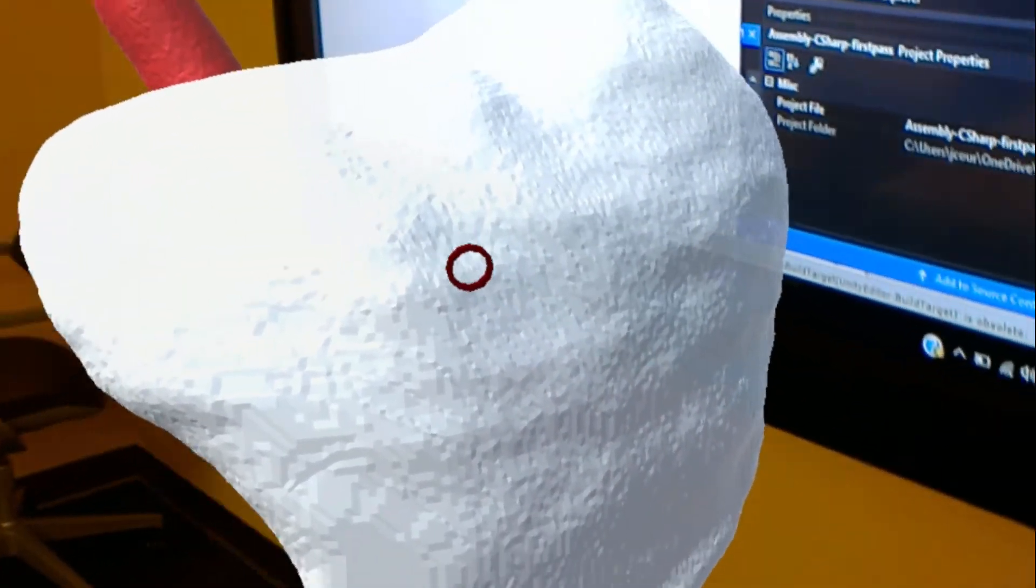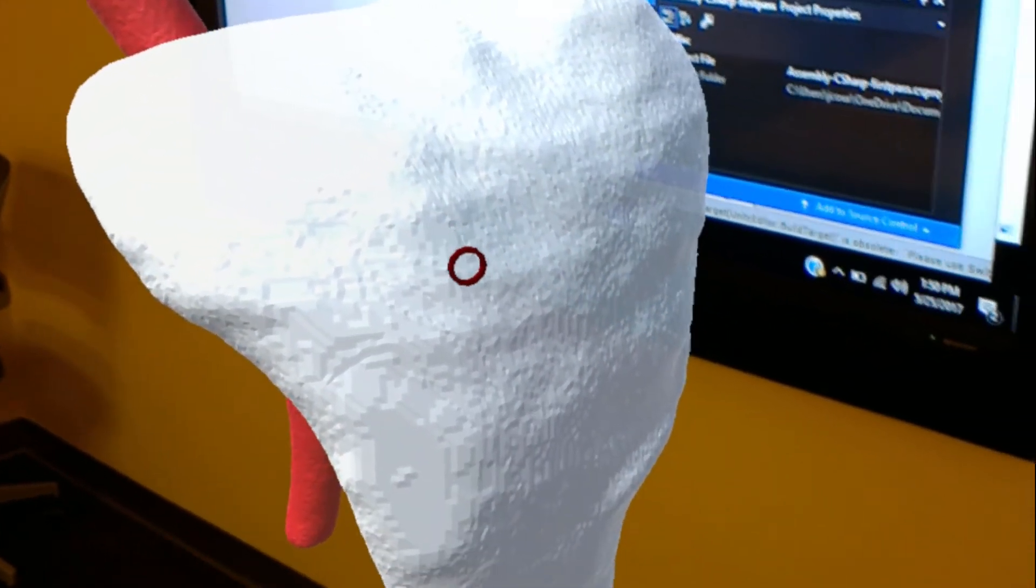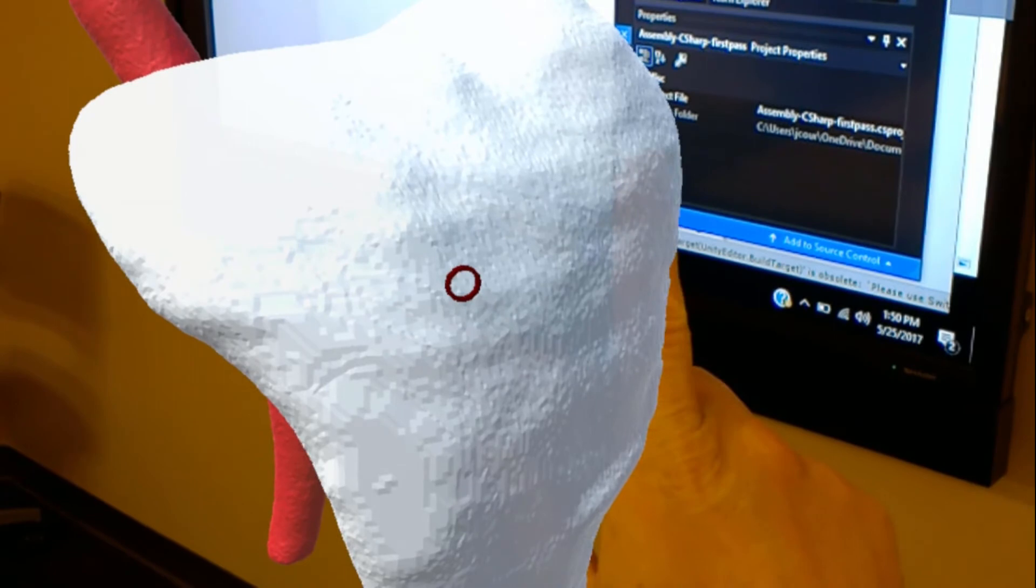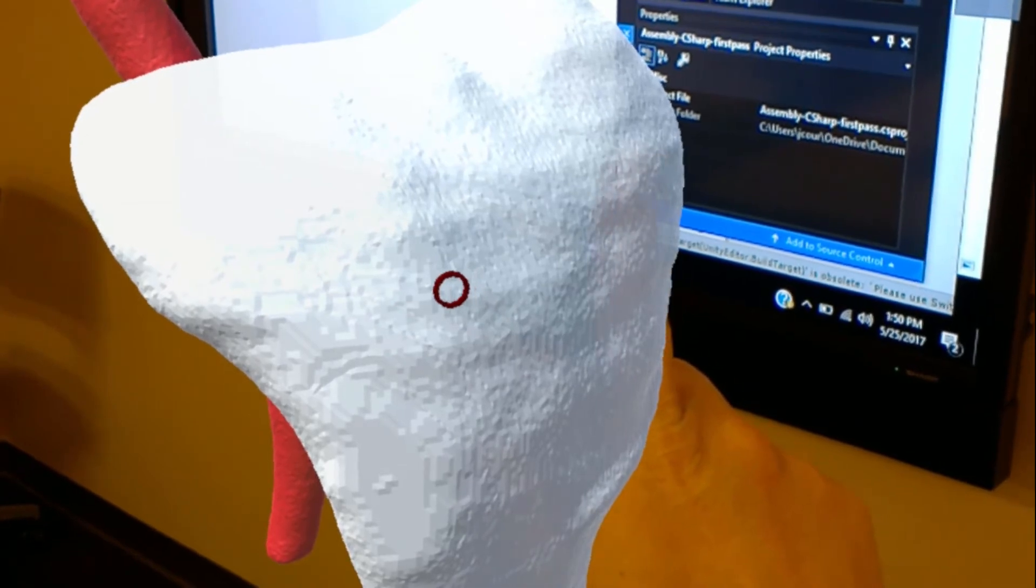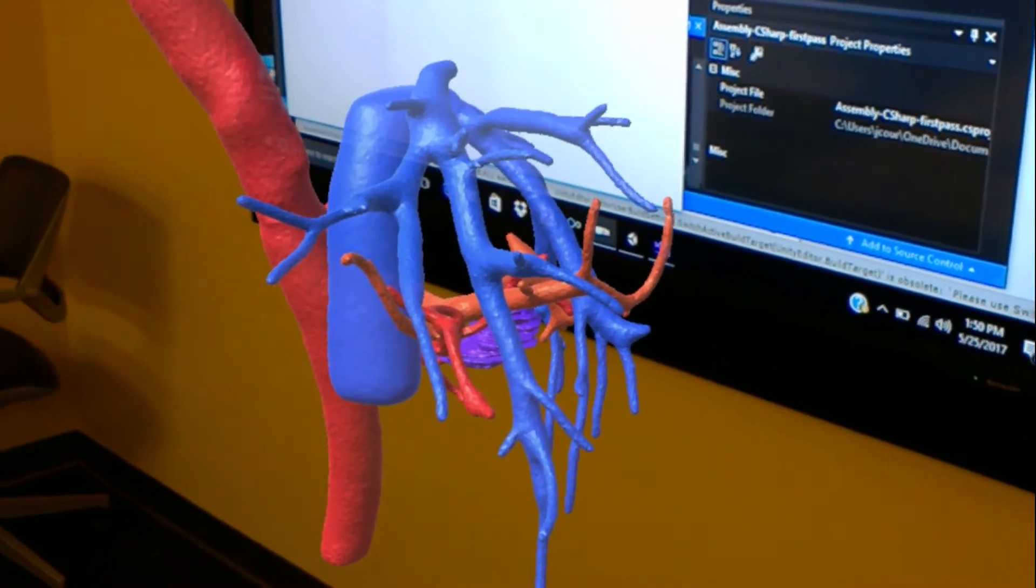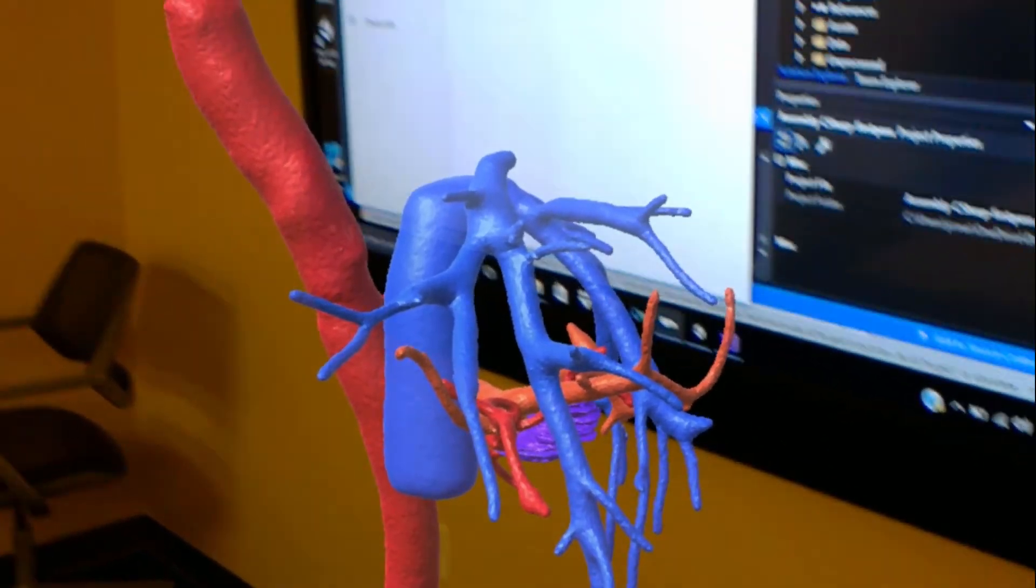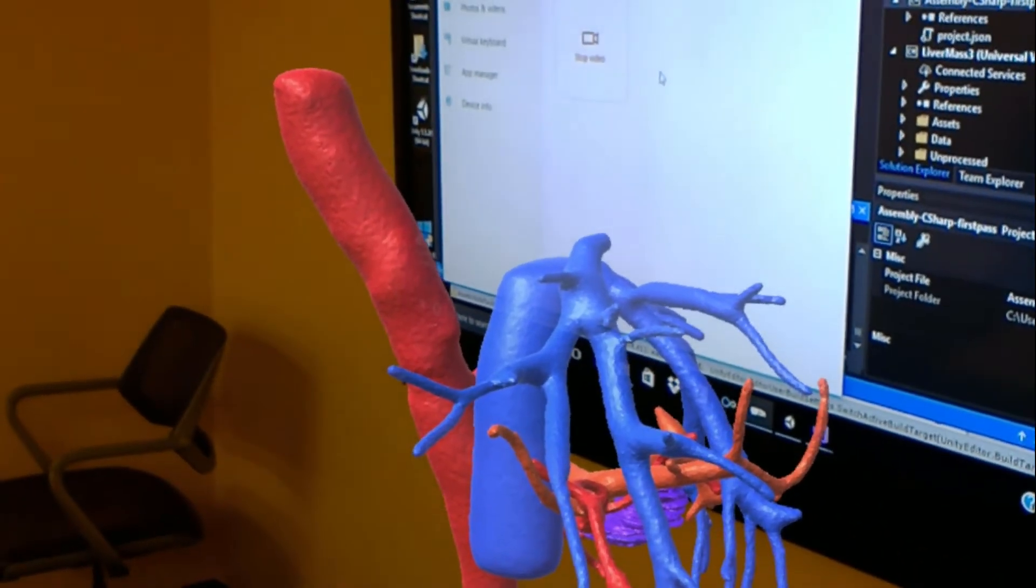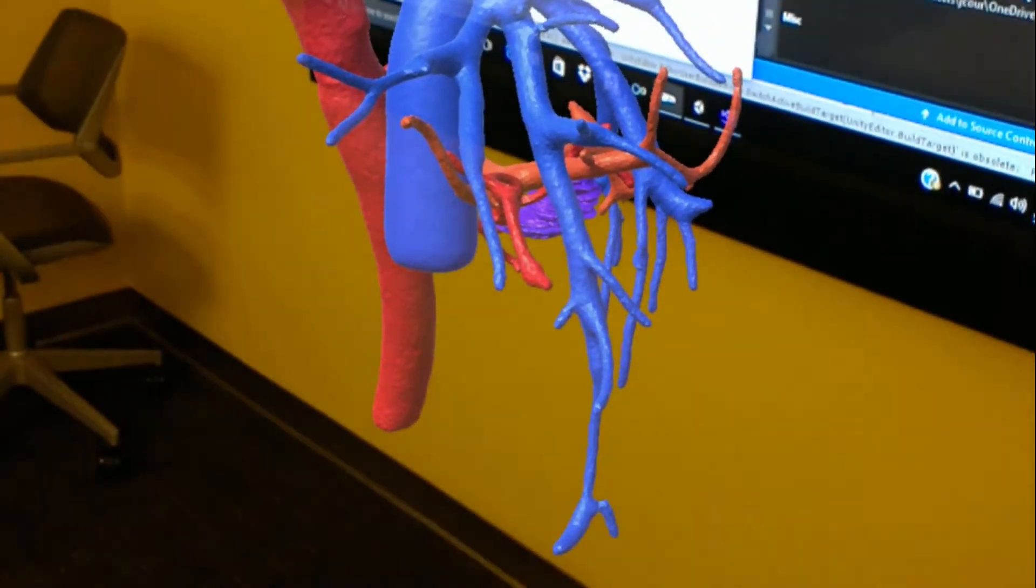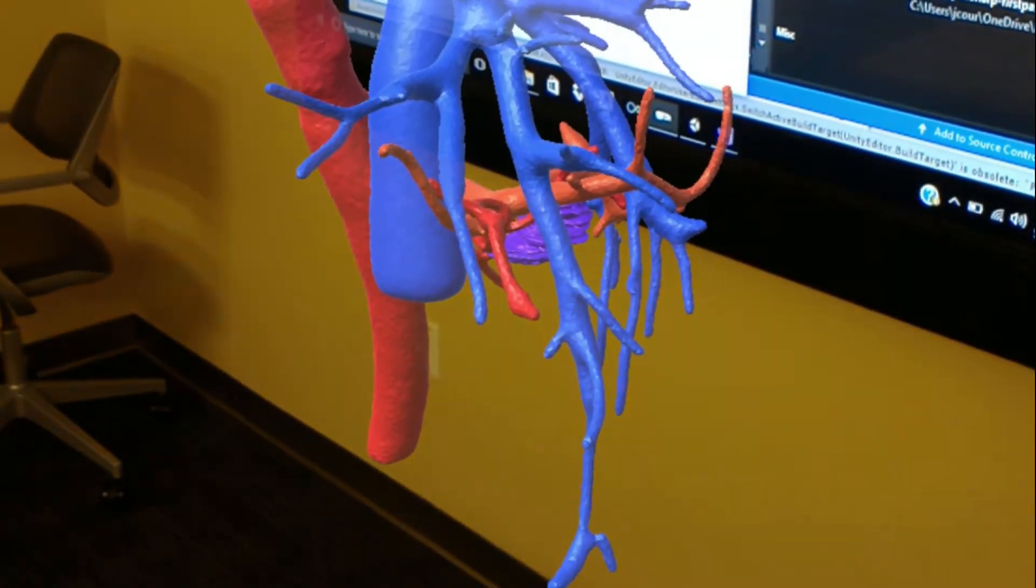But say we don't want to see the surface from far away. We can use a simple click and remove those structures, and now we can see the entire structure of the liver.